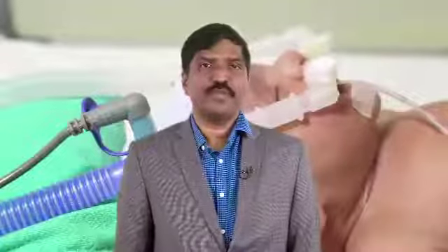When using a CPAP machine, always prefer a disposable circuit that is best suited for the type of machine. There is no need for routine scheduled replacement of the CPAP circuits. One circuit can be used for one baby. Always fill the water chamber of the humidifier with distilled water and use the autofill option available in the disposable circuits. Clean the CPAP machine with a soft cloth and ensure there is no water logging in the CPAP circuit at all times.